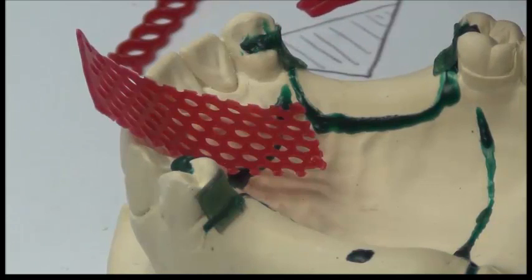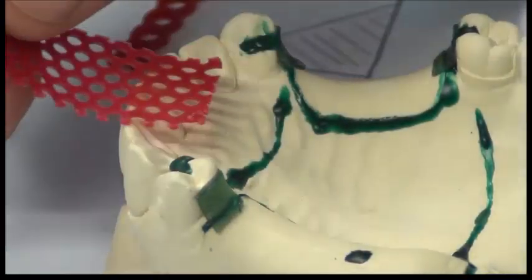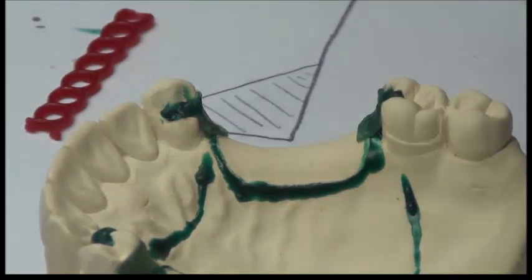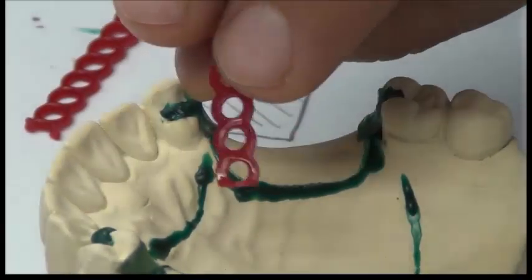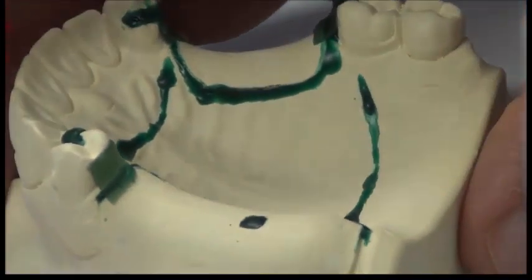But for today, we're going to do it for the upper and the lower. In the free end saddle area, we're going to place the open lattice. In the bounded saddle area, we're going to place the mesh design, okay? So this is the open lattice design. The shiny surface is down towards the tissue, and I'm going to place it on the free end saddle area.